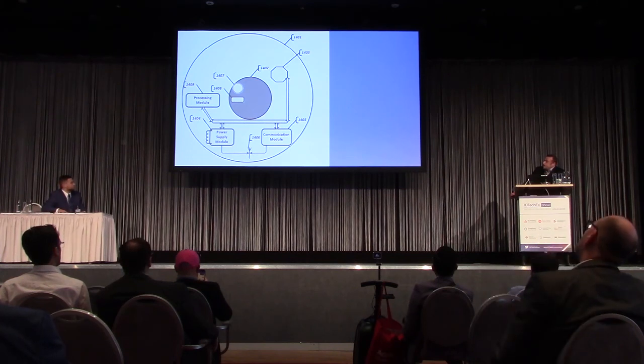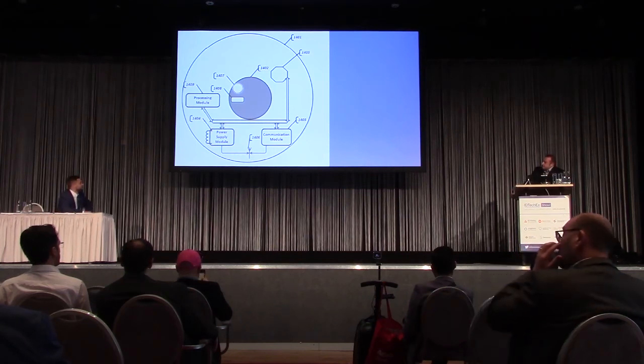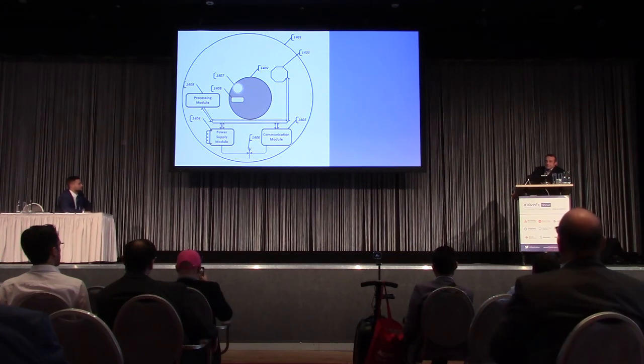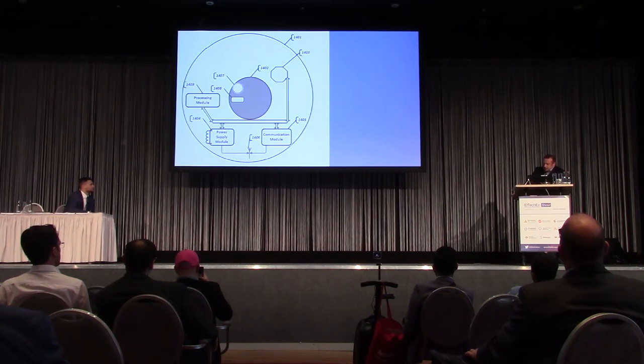So by looking up at record, accommodating to the record button as a UI component, you can actually initiate a function in the system so that the image capture device starts processing imagery and possibly recording it on internal memory or transmitting elsewhere. That's the idea. Again, everything that you do is happening only with your eye, through attempted accommodation. I think this is it.